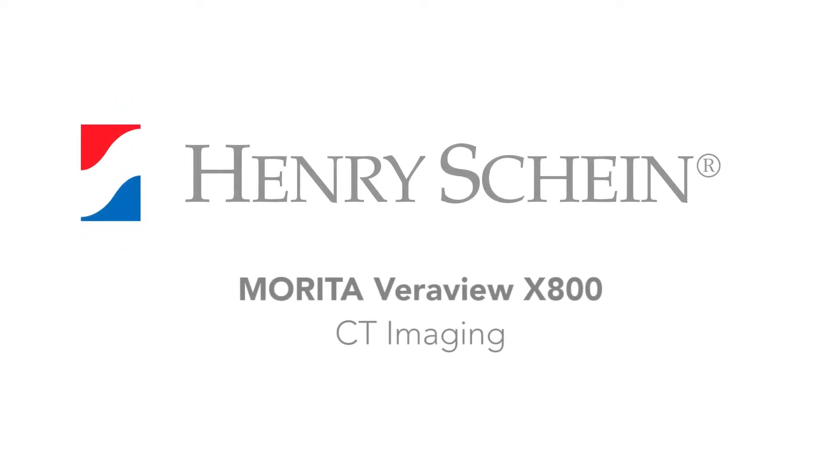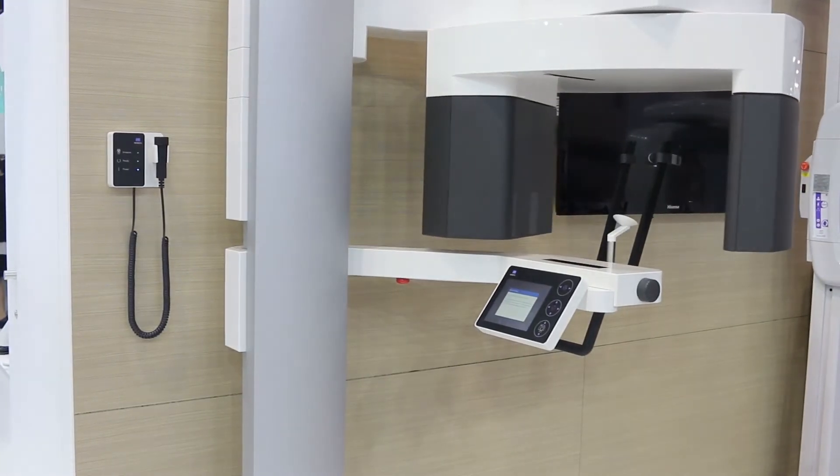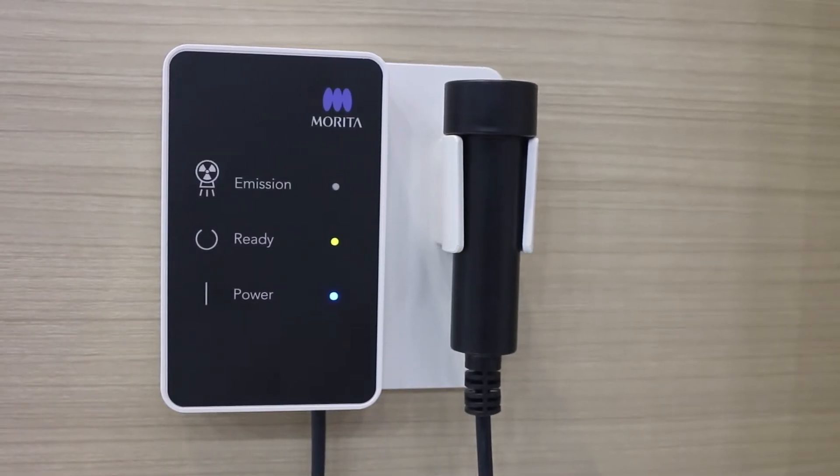The Merita Veriview X800 can perform both cone beam CT imaging as well as traditional panoramic imaging. Acquiring a cone beam CT with the Veriview X800 is a simple procedure.